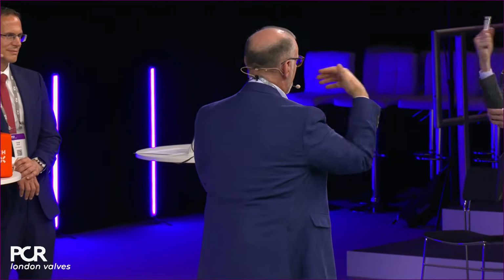I think that's what I made the drawing for. Correct me if I'm wrong, but that's the feeling that I had in roughly my first 10 FX cases. The difference, because maybe not everybody appreciates that. What does it mean, that single spine or double spine? Can you do it with your hand? The old Medtronic slide was that with the old Evolut Pro, you could only do this but could never do this. There's only one range of movement. Yeah, with the new FX, there is more flexibility. You can do like this with a catheter, yes, but in the past with the Pro, you were limited.